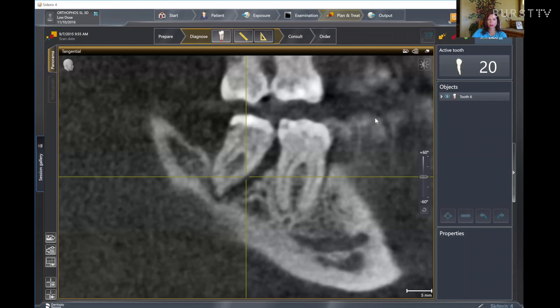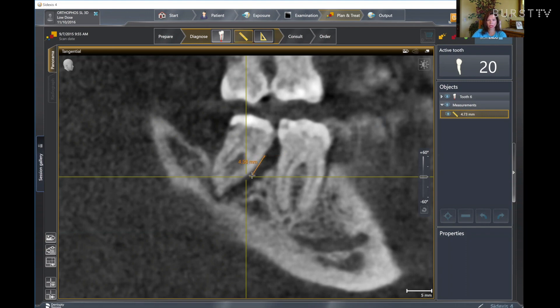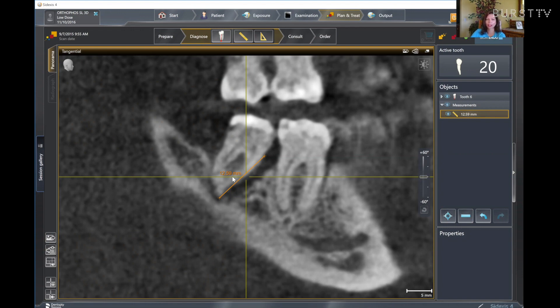Now we're going to look at the same patient at tooth number 31. Here we can see how severe the defect is with the bone loss on the tangential view — and we can measure this as well. Using the measuring tool, starting at the CEJ and following the path, it goes all the way down to the apex. Measuring straight to the apex, it is a 12.59 millimeter pocket. If we can visualize how deep that goes, the doctor will help diagnose if this tooth is worth saving. Regardless, it gives good information on how to get into that area more effectively for the patient.